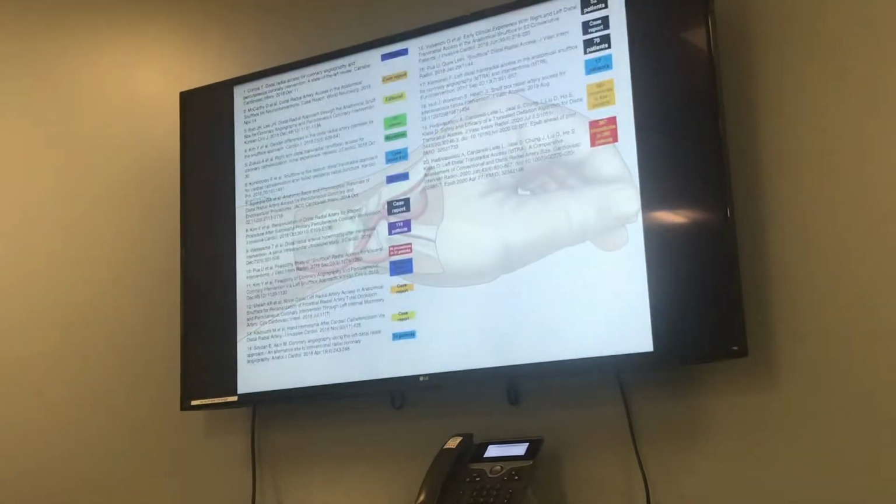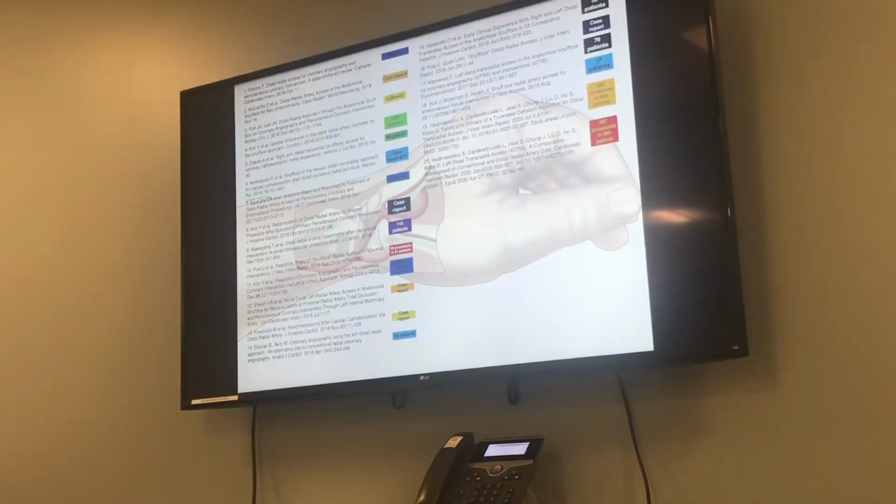The only thing is, because it's such a superficial vessel, even if there's a little bit of bleeding or even a little bit of local anesthetic that fills that snuff box, it will seem as if that patient has a hematoma. So I can almost guarantee that you are noticing more hematomas in the snuff box than conventional, but it's not a hematoma. It's often just local anesthetic or whatever that we fill the snuff box with. So just be aware of that. You can bleed into the snuff box, but what you're feeling is probably just residual fluid or a little bit of bleeding as the sheath came out.